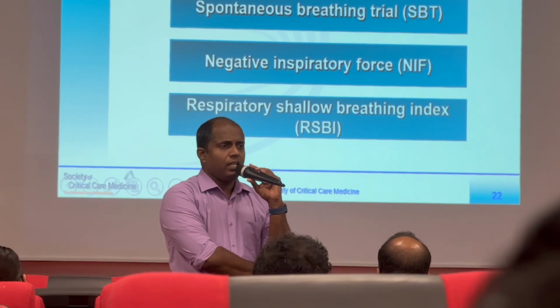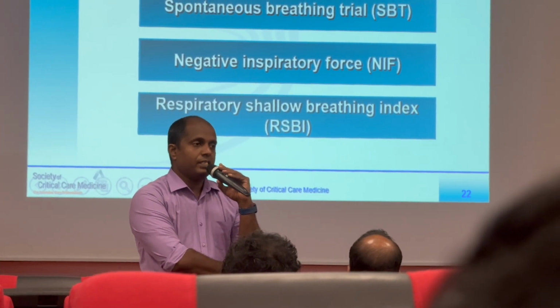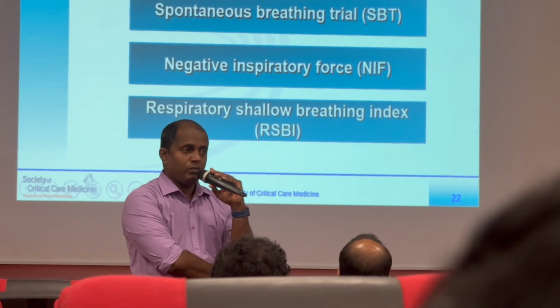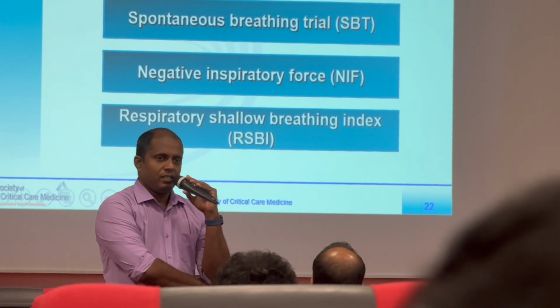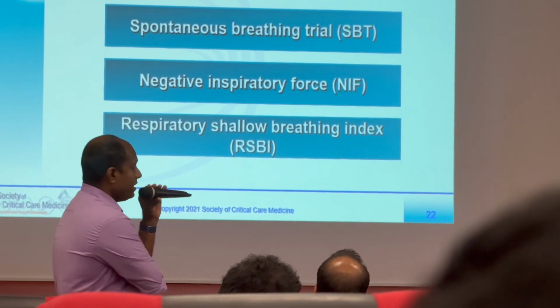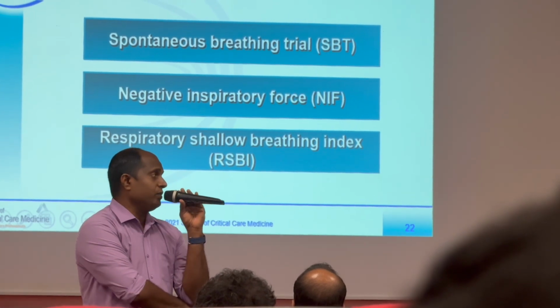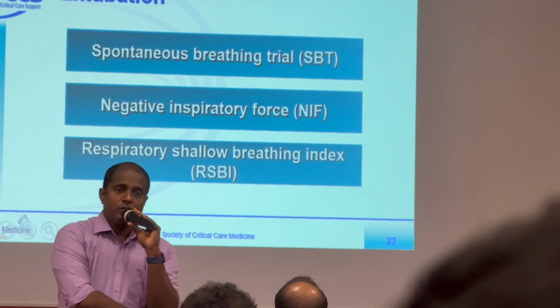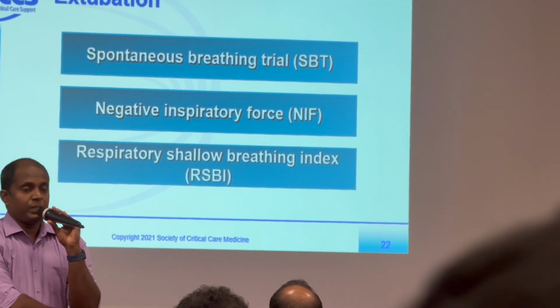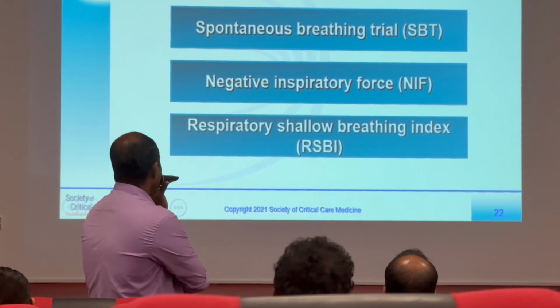We are measuring how much negative pressure the patient creates on his own while on positive pressure ventilation. Guys, you finished the mechanical ventilation one, so you know what we are doing is positive pressure ventilation. But the patient physiologically breathes with negative pressure. So we see how much negative pressure he can generate. That is negative inspiratory force.